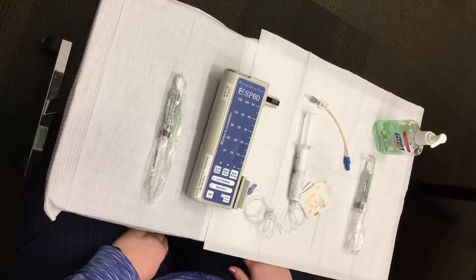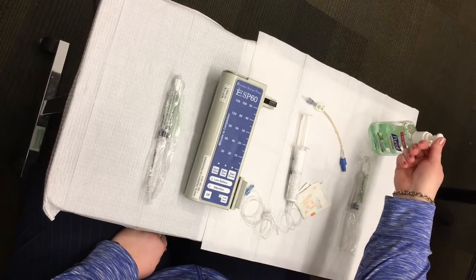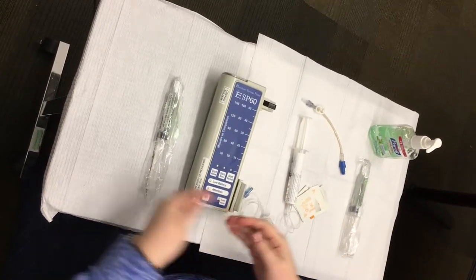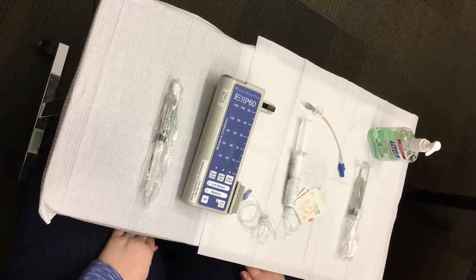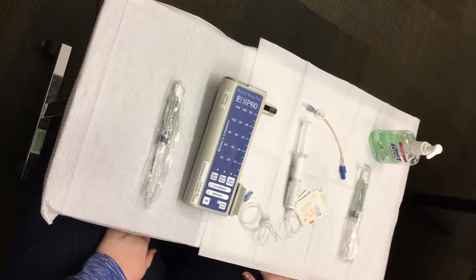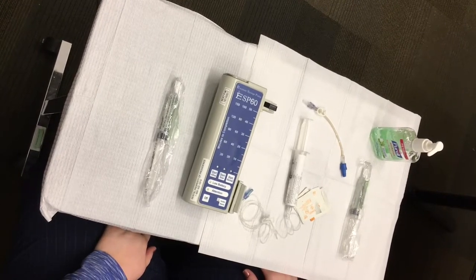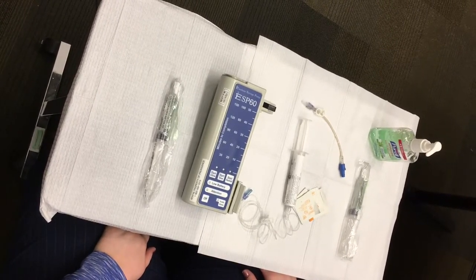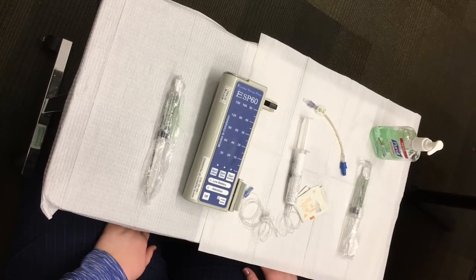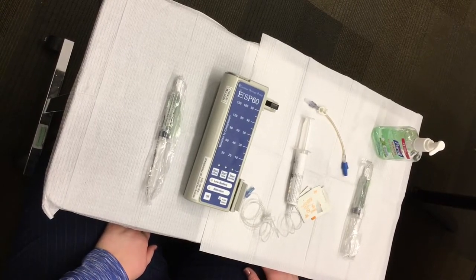As in the previous video, you should have already washed your hands, prepared a clean workspace lined with paper towels, and gathered all the supplies including the medication syringe, Excelsior syringe pump, tubing, flushing syringes specific for your type of line, alcohol wipes, batteries, waterless hand cleaner, and a sterile red cap if you have been directed to use one.